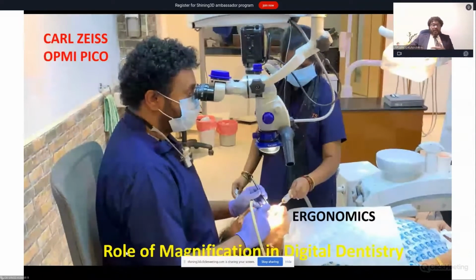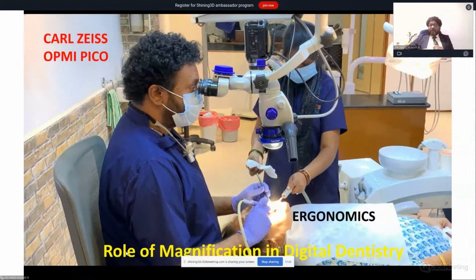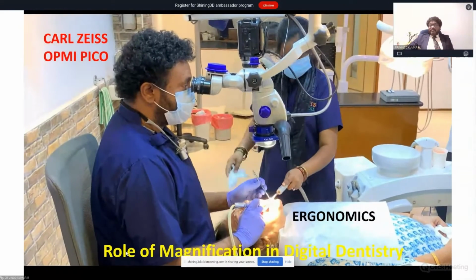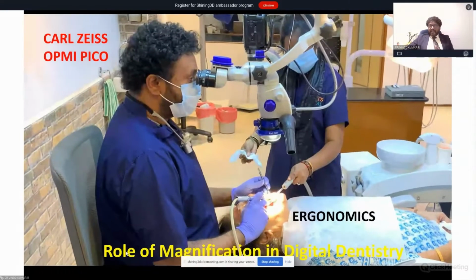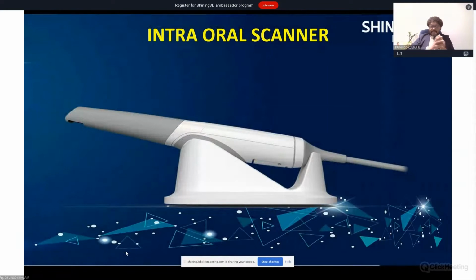So even if you're going to go into digitalization, ultimately dentistry depends on the clinical skills. If you're not able to do a procedure, the digital technology will only capture whatever you have done, it's not going to modify anything. It is just going to capture what you have prepared. For you to achieve the best results, you have to have at least a minimum 2.5x magnification, so that your digital technology will not slap you back and say go back and correct this. So that is one of the major reasons why you should upgrade to magnification, at least 2.5x.